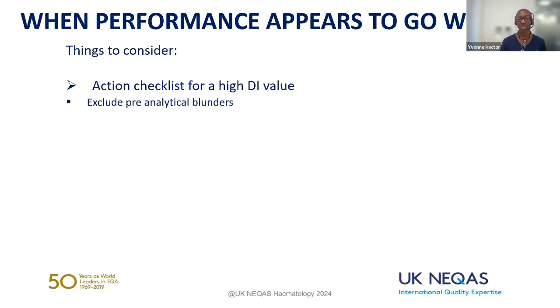It's the same when participants email me saying they're concerned about a high DI. I tend to go back, look at their performance, look at what's happening with the group, and look at the spread of data to see whether there were any additional erroneous results that weren't trimmed through the natural process. Those might be ones that we want to further exclude and then rerun the stats on.